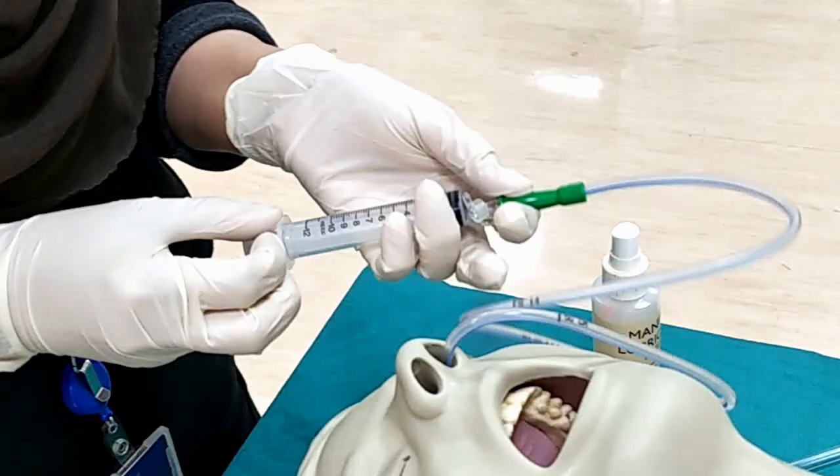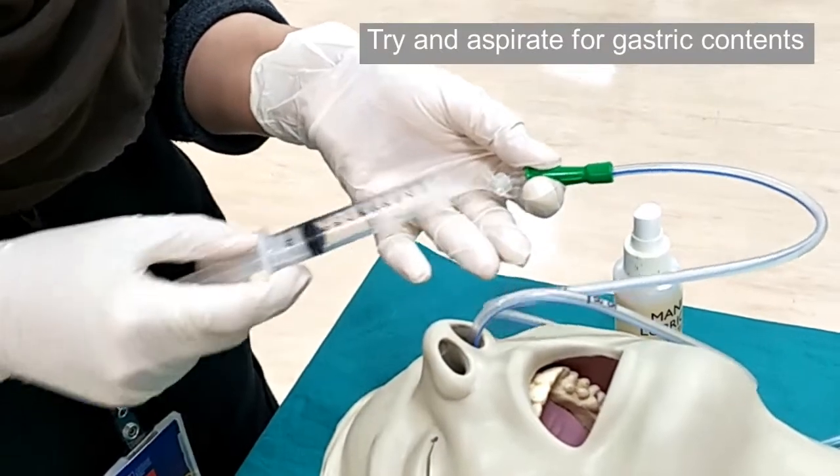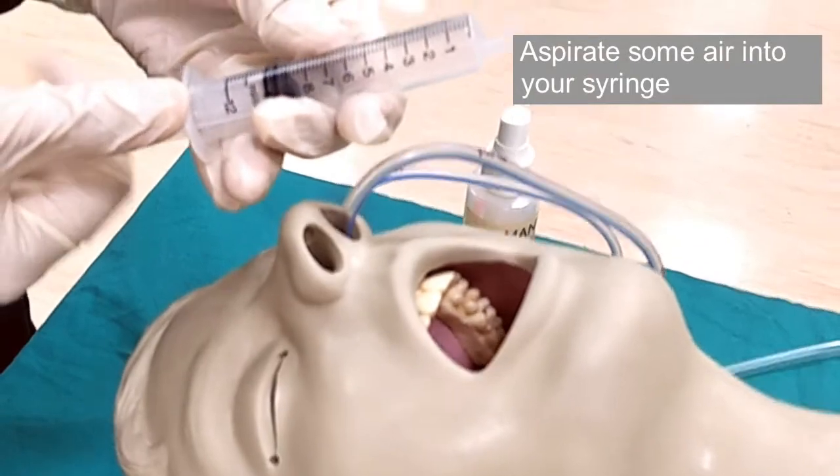To check tube placement, first attach a syringe to the port of the nasogastric tube, then attempt to syringe out the gastric content. Next, remove the syringe from the port and aspirate some air into your syringe before placing the syringe back at the tube port.